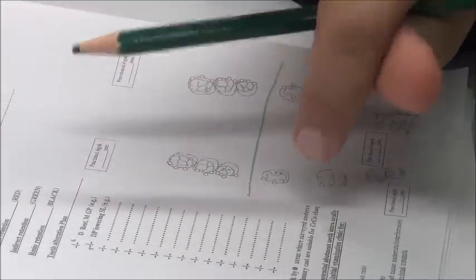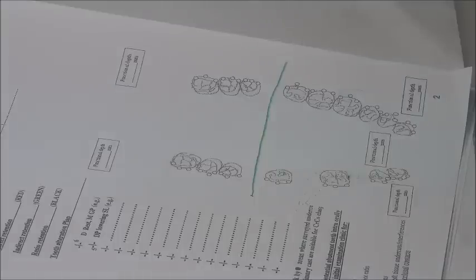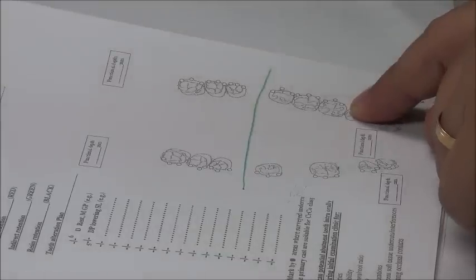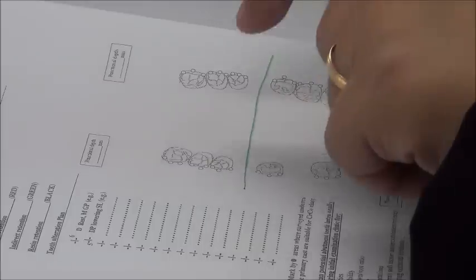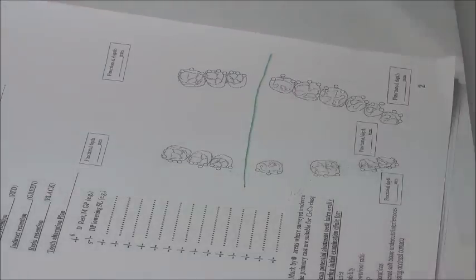And with the cross-arch stabilization, I get support, I get reciprocation, I get retention, I get stability, and I get indirect retention. Do you remember indirect retention? I need indirect retainers. Okay, so sometimes we extend for indirect retention as well. Okay? Now, once I place two clasps here, the best design with cross arch stabilization, for every rest here, I have an opposite rest. So the rest on the 8, it's better to have an 8.